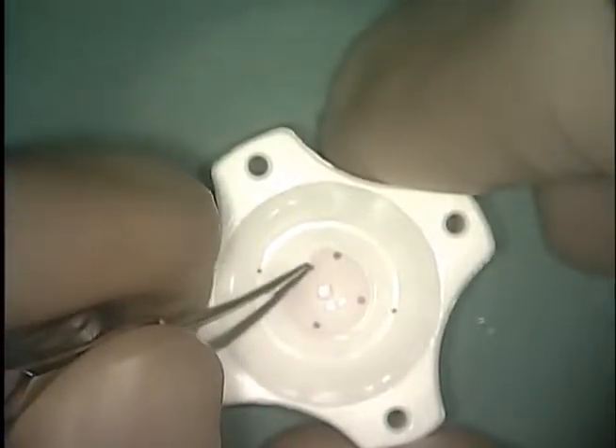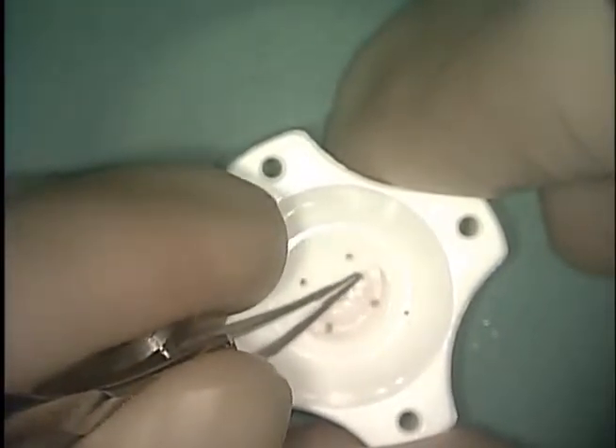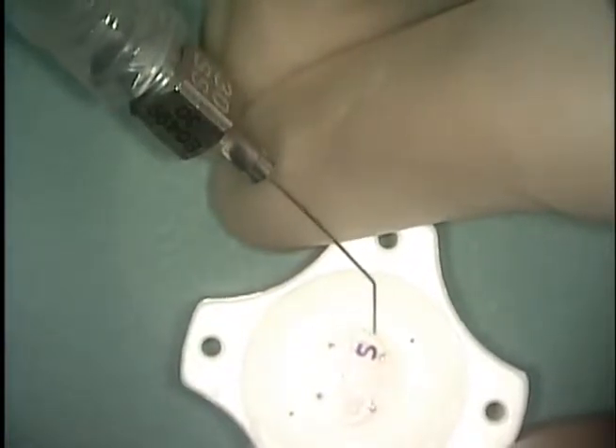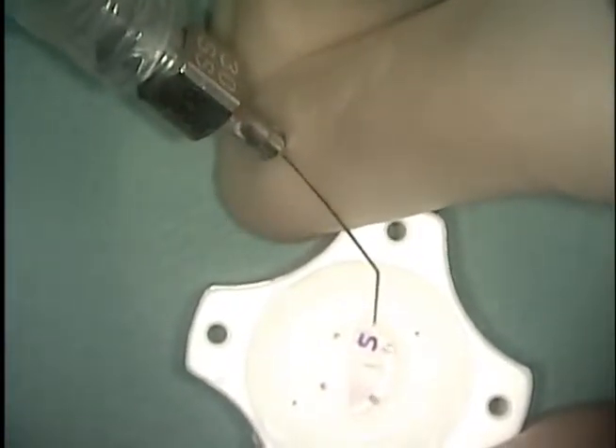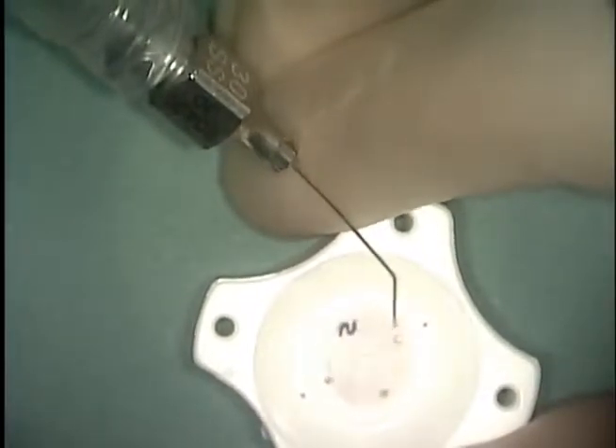Next, the graft is folded over on itself. An S-marker creates an S-mark on the stromal side of the graft. This will allow us to confirm correct orientation of the graft in the eye. The graft is then unfolded using BSS. You can see the S now appears backwards as the endothelial side is facing up.